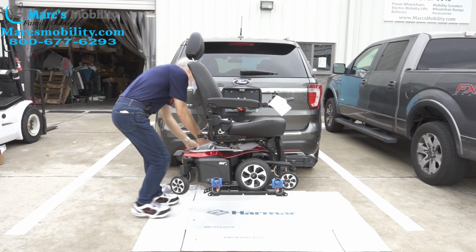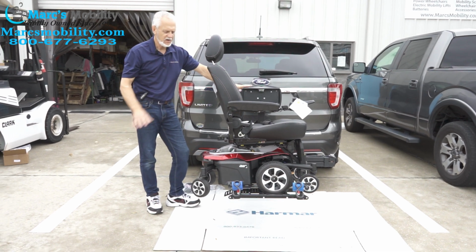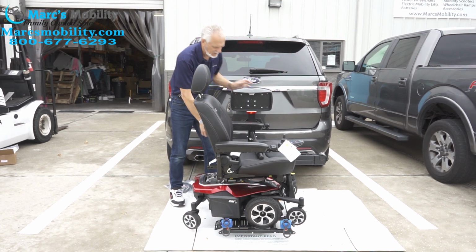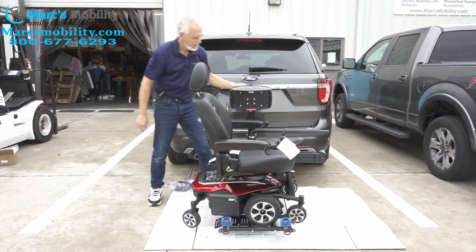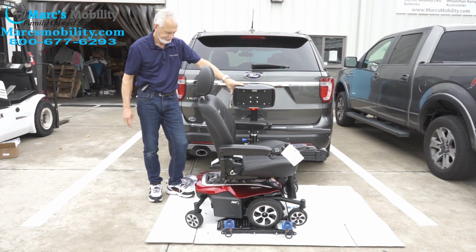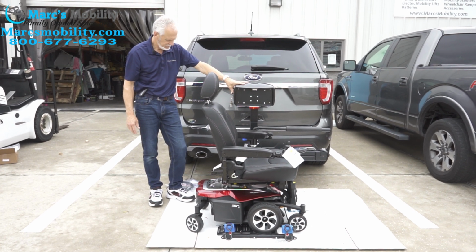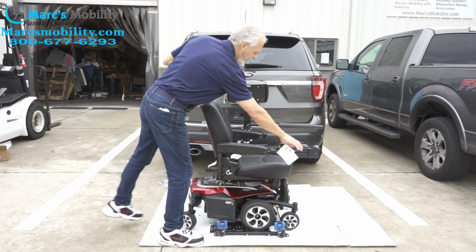So you do your 4 straps. The nice thing about this, you got 2 different secure points. You got the straps, and you have the arm that's over the seat. And then take your arm off. As I said, you'll have to adjust the arm for whatever chair you put on here. And then turn your power back on.